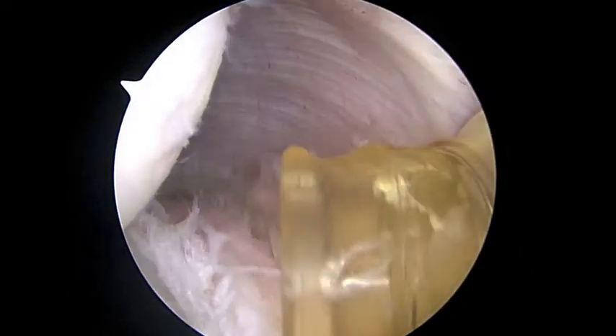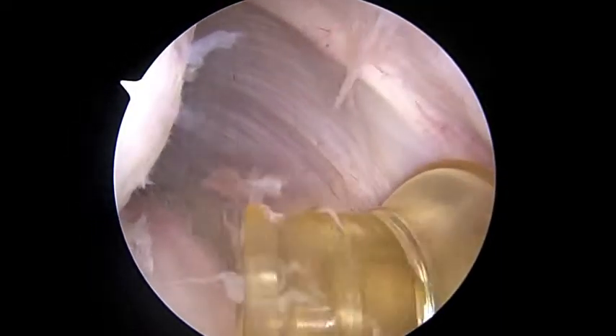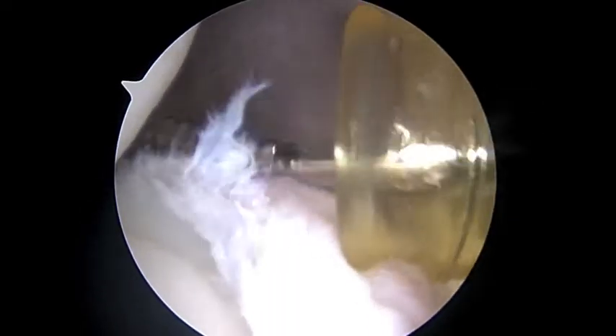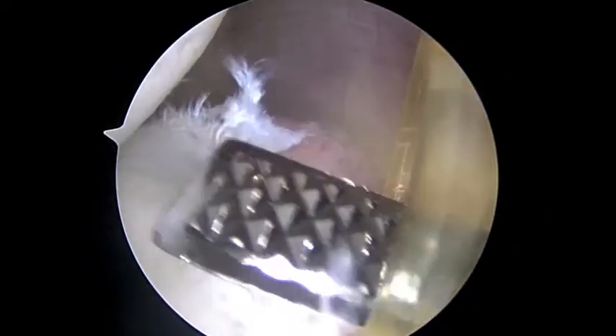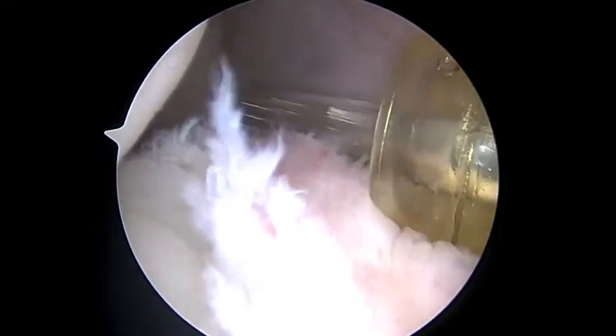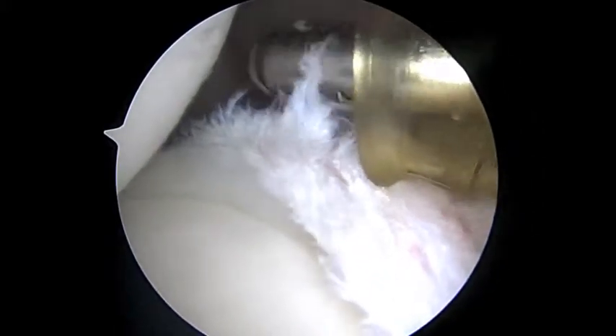Now we're looking from the front to the back. This is the back of your shoulder — we have this yellow cannula coming up. I'm trying to back out this yellow cannula a little bit to get a little more working room. You can see how this labrum is torn and not normal here, and that's why we're going to use suture anchors. We're using this burr just to rough up the capsule a little bit, then I'll put a shaver in — but I don't want to shave away too much.